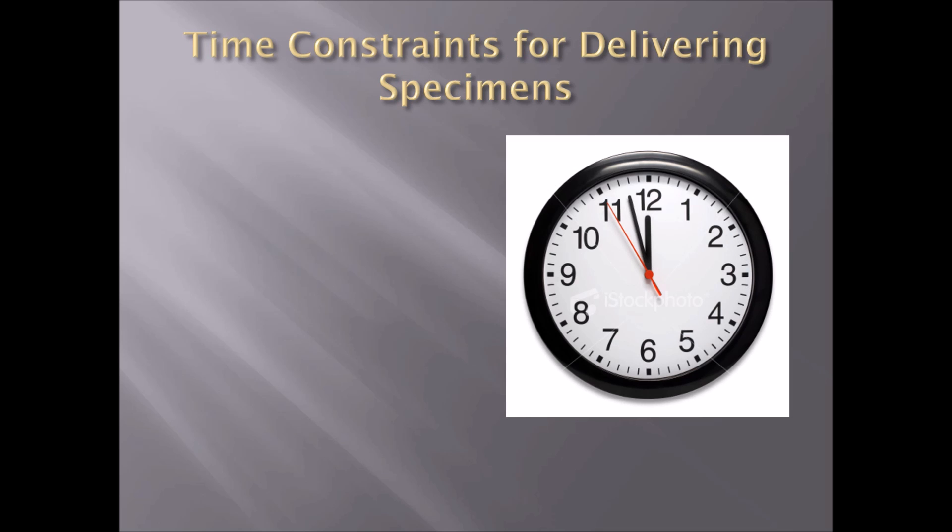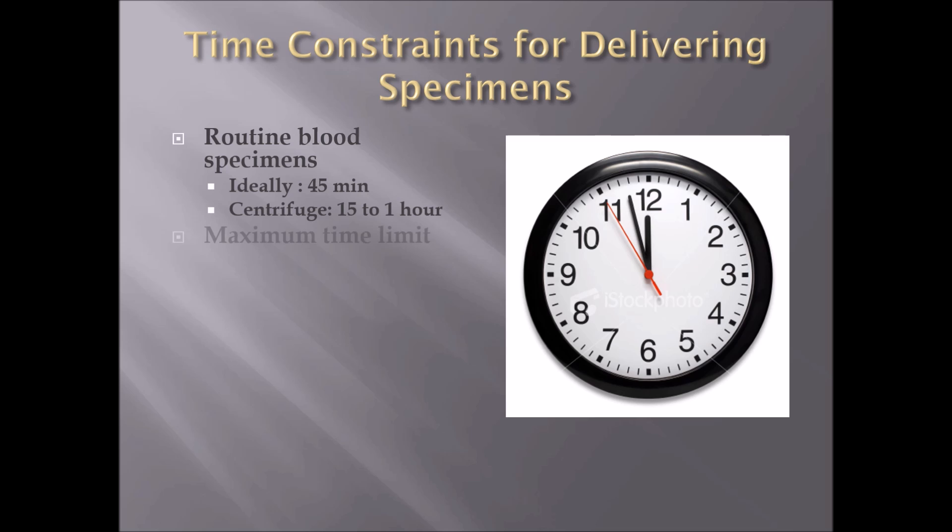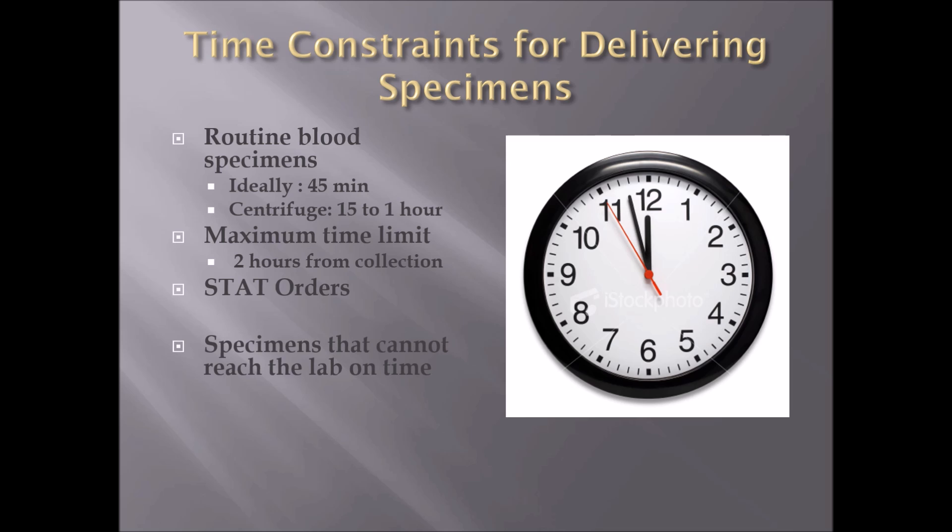With time constraints for delivering specimens, routine blood specimens ideally need to be in the lab within 45 minutes, placed in the centrifuge between 15 minutes to one hour depending on your lab requirements, with a maximum time limit of two hours from collection. Stat orders go first — they are the first priority above any routine draw; stat means immediately. Specimens that cannot reach the lab on time must be allowed to clot, be centrifuged, and have serum or plasma extracted to be prepared for shipping.